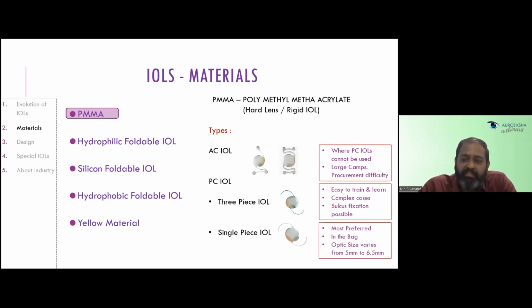They are the most preferred, and they can be implanted inside the bag. And they come in various optic sizes from 5 mm to 6.5 mm. The most commonly used is the 6 mm optics.